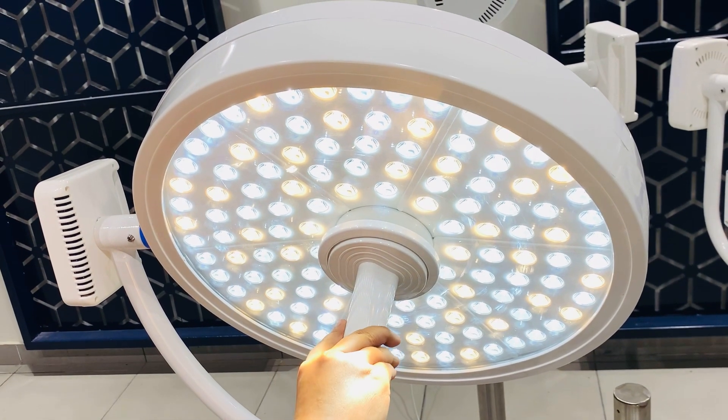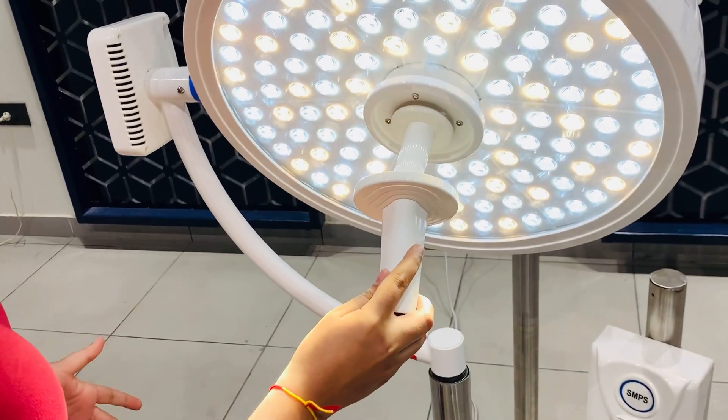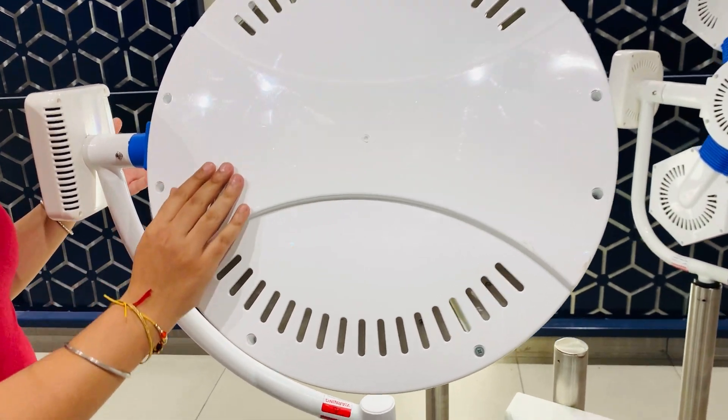This sterilizable handle is easily removable. On the back side of the dome, we have provided a European design for the heat ventilation.